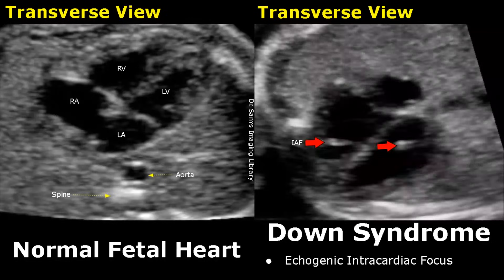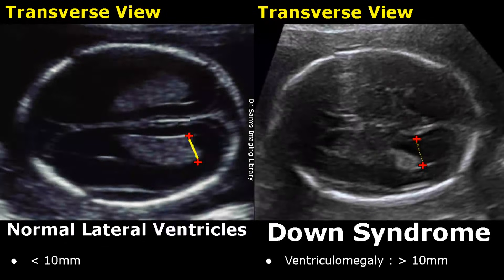In this image we see two echogenic structures, which increases the chance of having Down syndrome. Here is an image of the fetal brain showing normal lateral ventricles; their normal measurement is usually less than 10 millimeters.